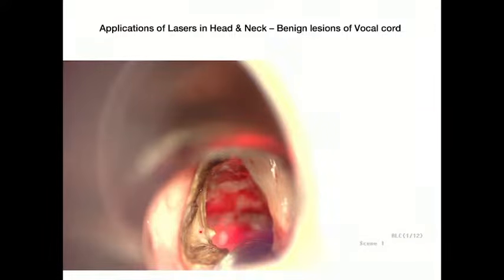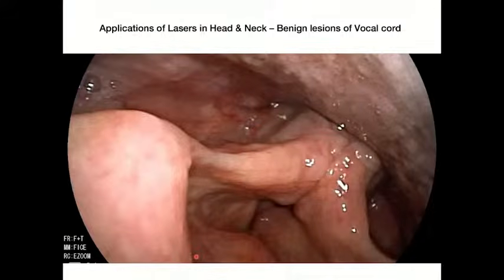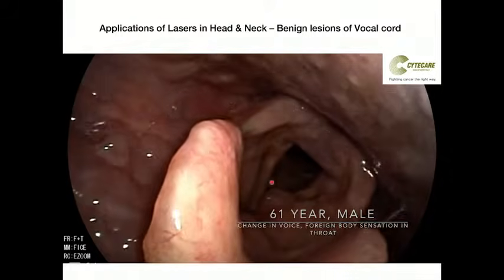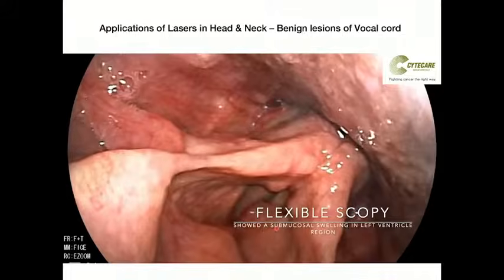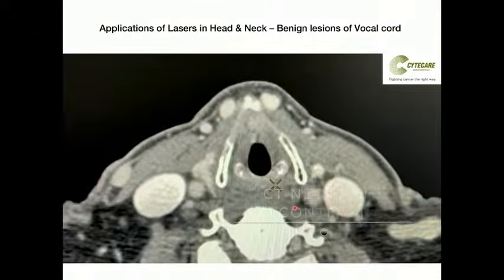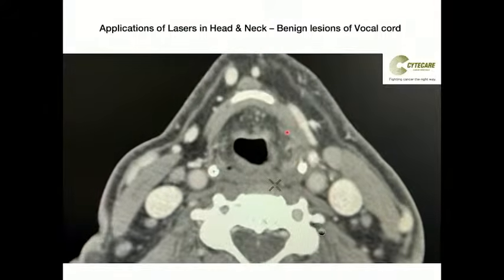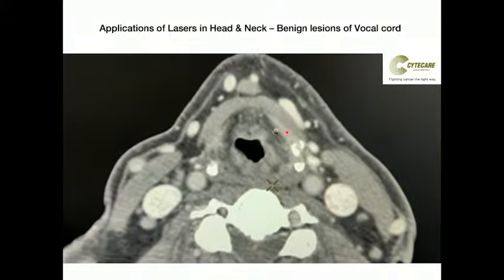But by having good hemostasis available, we keep an electric suction on standby. We know that the technician who works with us is inside the OT and not outside, so we should not shout and make a big mess. This is an area where there is going to be bleeding, and you need a monopolar suction cautery to maintain hemostasis. And as I told you, have a wet gauze piece or neuropatty to wipe away the granulation tissue and so on. Again, these are all done as day care surgeries, so they can go home 6 hours after the operation.